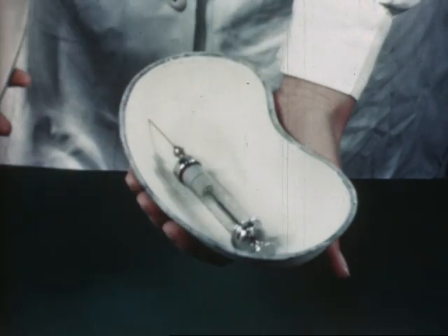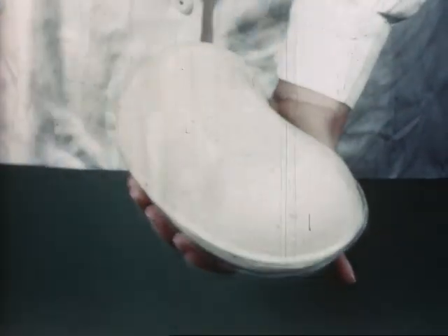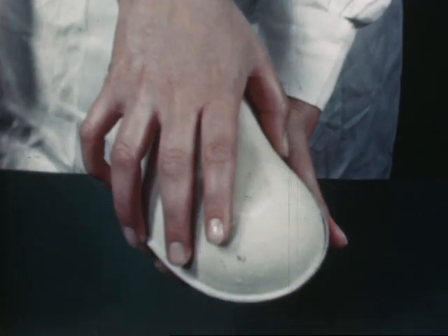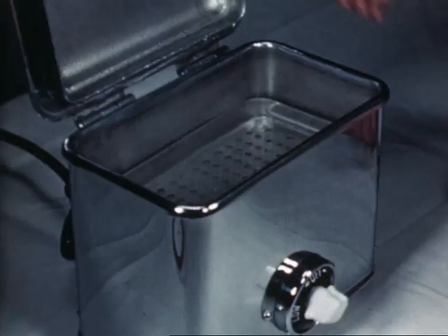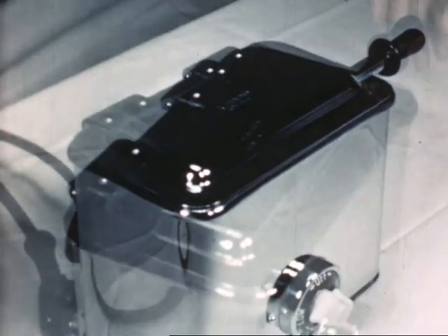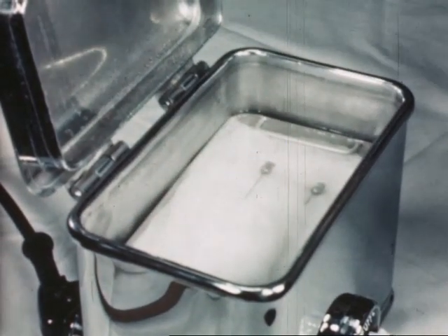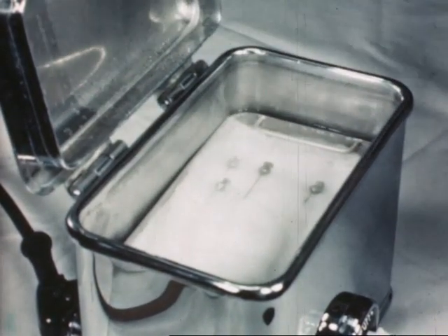Sharp needles will soon be ruined if they're not handled carefully. When carried in a kidney dish they should be properly protected. They will also be ruined by incorrect storage. Don't put too many needles into the steriliser at one time, and space them well apart on lint.